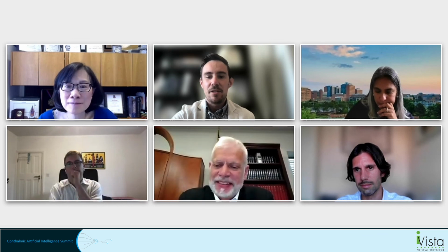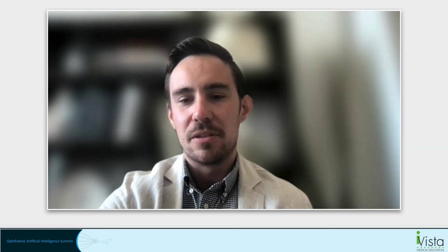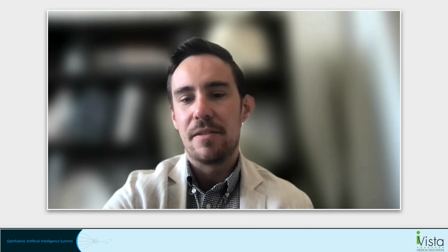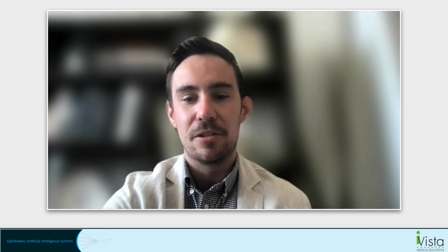I totally agree with both, and I just want to add a little bit on the validation piece. Extensive validation, I think, is the most important thing. I think it's more important in building trust than explainability, quote unquote. And yes, if you have a segmentation network that feeds into a classification network like the DeepMind algorithm, that helps because you can see the underlying segmentations.